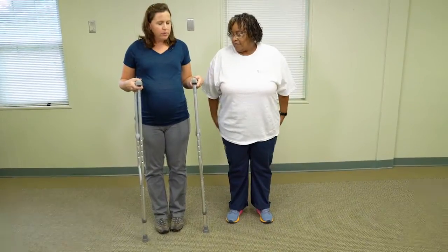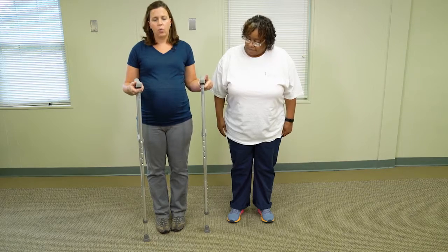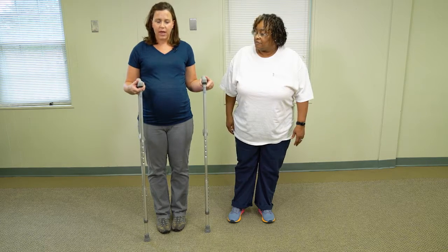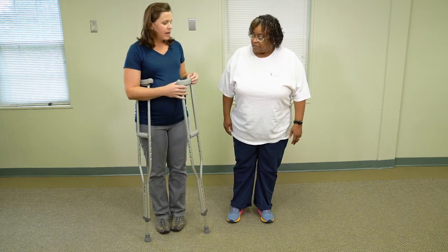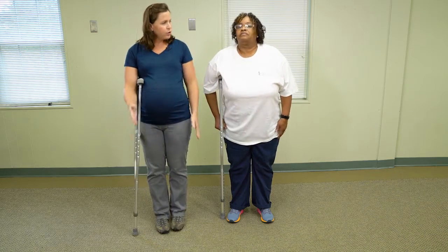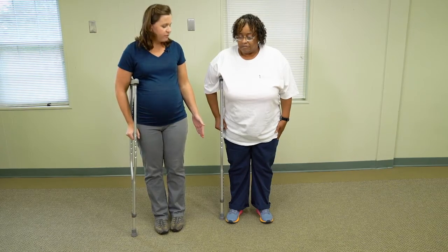After a while, you can probably progress yourself to using just one crutch. If you're still limping, you definitely need to have something to help take pressure off of that leg. Since we're using your left leg as your affected side, you would actually use this crutch over on your right side here. It goes along with the normal walking that you would do, and it will help keep the pressure off of that affected leg.